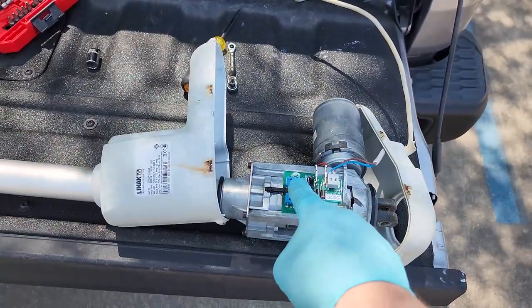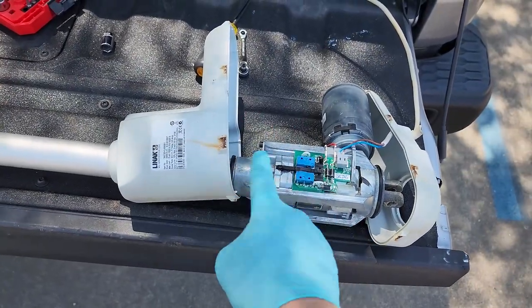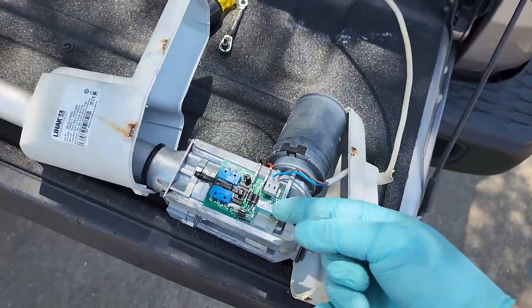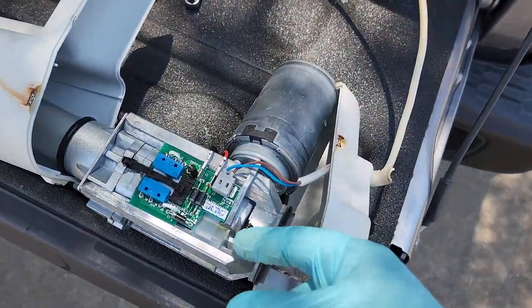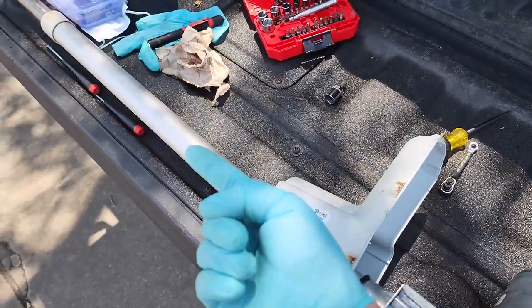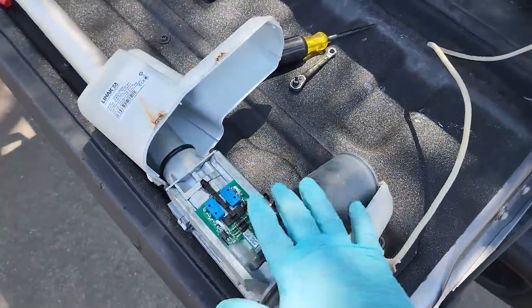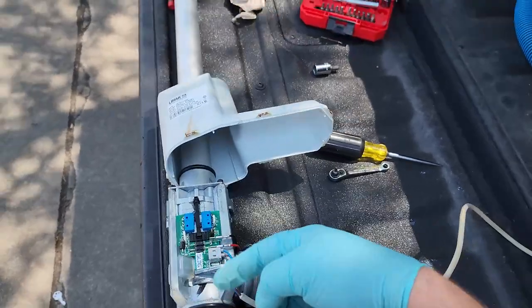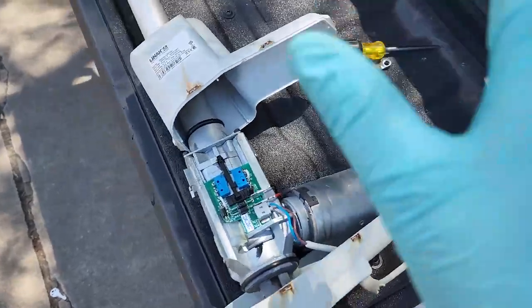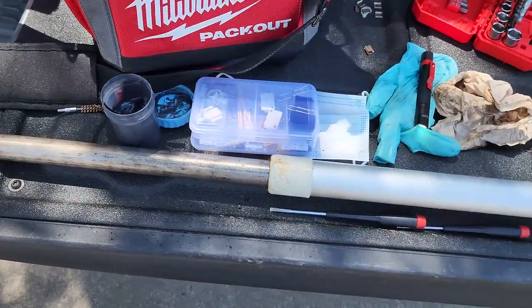So guys, that goes to show you, if they go in one direction and not the other, there are limit switches inside all linear actuators. Basically you have a motor here that has a crown gear, or it's gonna have a helical gear, and then that will actuate on a screw which drives it in and out. There's a lot of mechanical advantage on this because it is a gear to a screw, but they are prone to wear and tear, and as we can see here, it's just getting old.